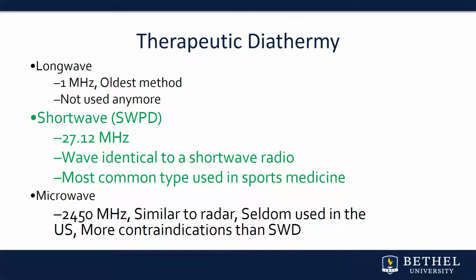Short wave is a wave identical to shortwave radio at 27.12 megahertz. This is the most commonly used waveform of diathermy in orthopedic medicine. And then there is the microwave, which is 2450 megahertz, similar to radar.